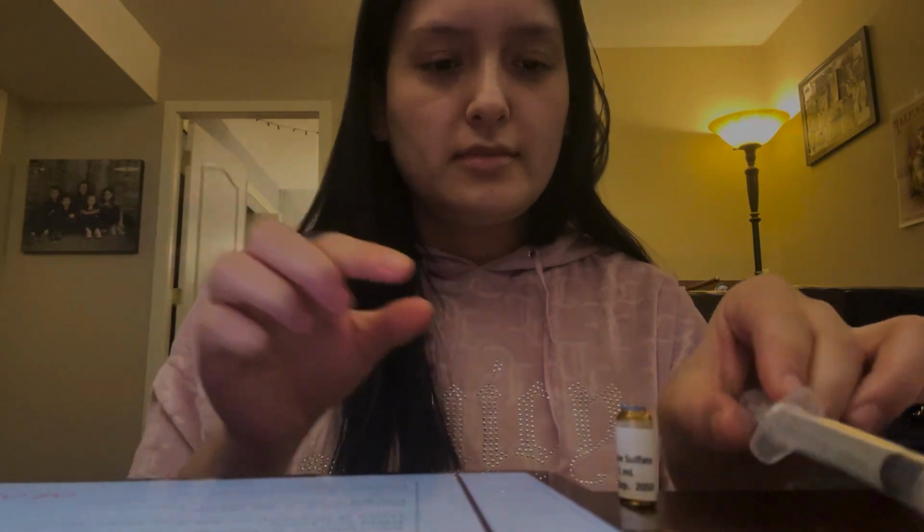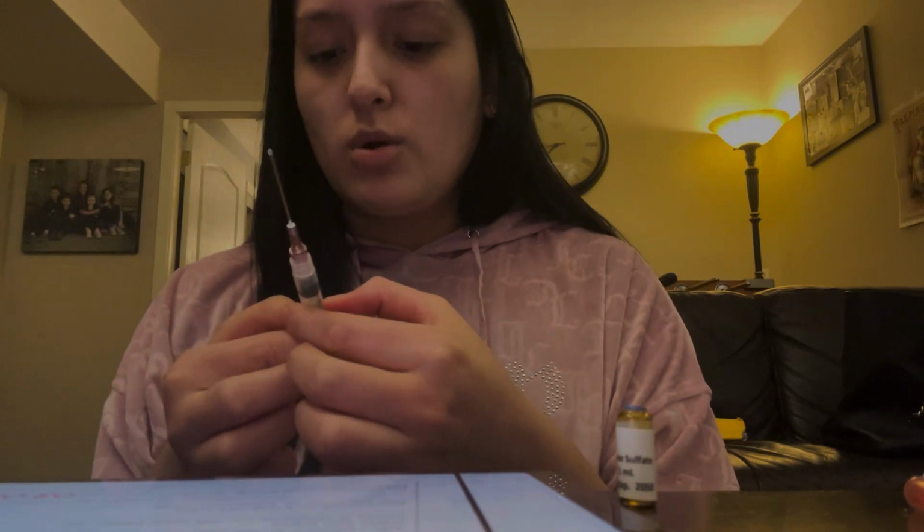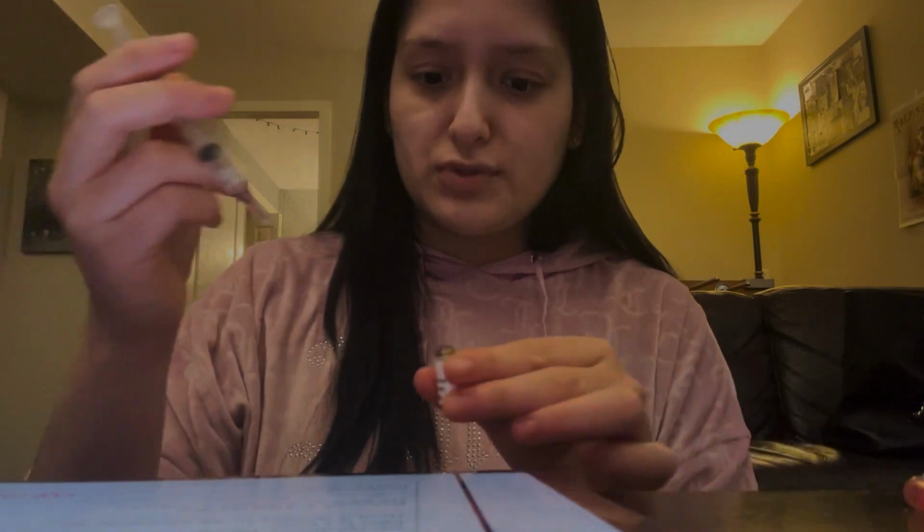So I'm now, with my blunt fill needle filter, I'm going to draw up 1 ml. So in total, I should have 1.5 mils of medication in my syringe by the time that I'm done.